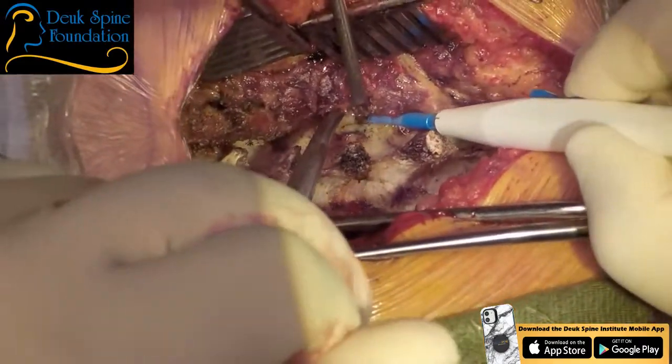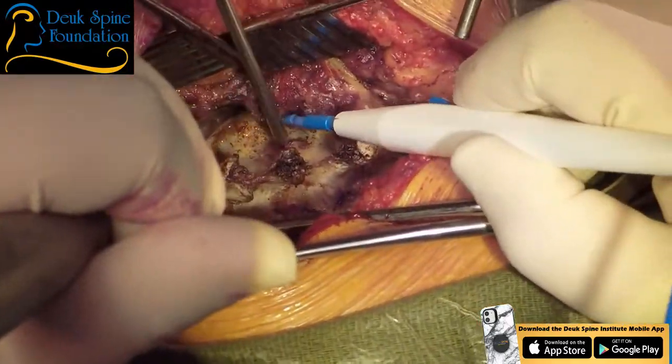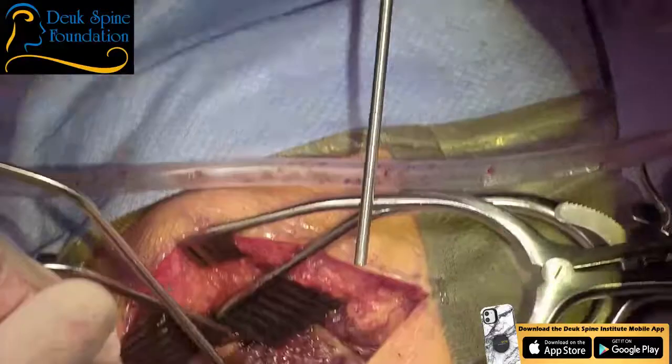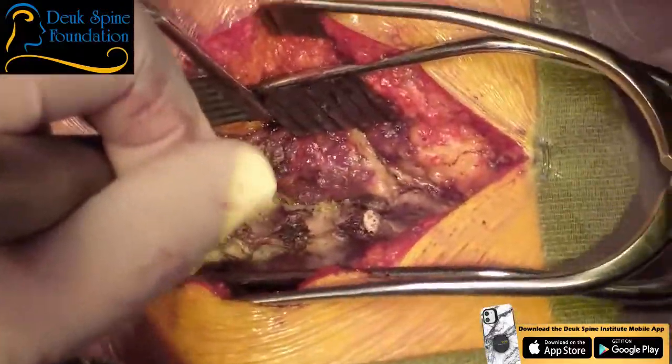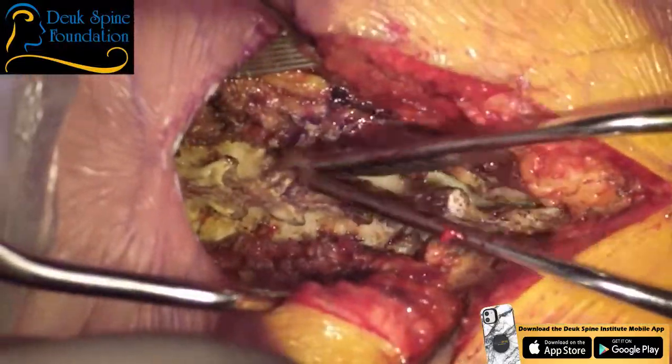There was a little fat pad there that was developed. You see that? Nice and juicy, basically to support some inflammation. All right, I'm going to reposition the retractors, and now we're going to go deeper. We're basically almost at the end of our exposure.